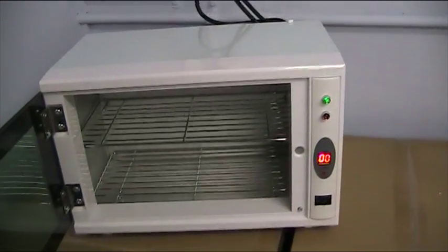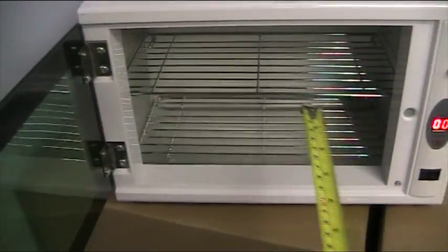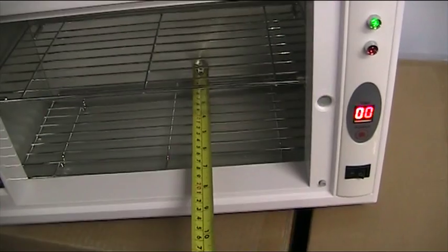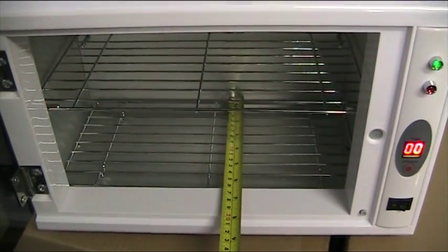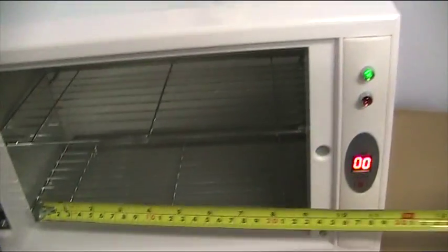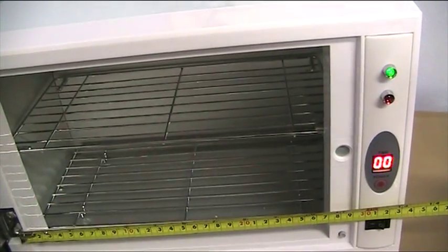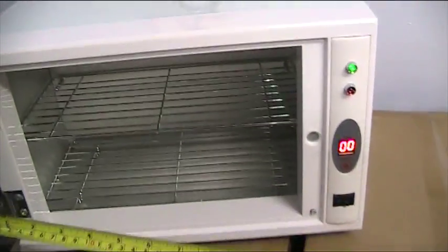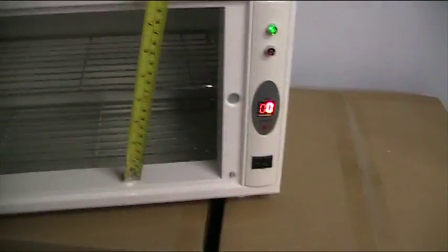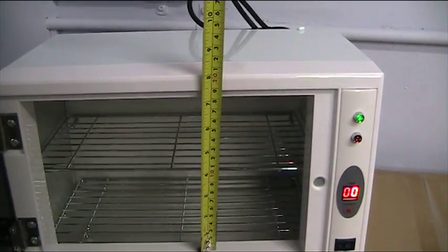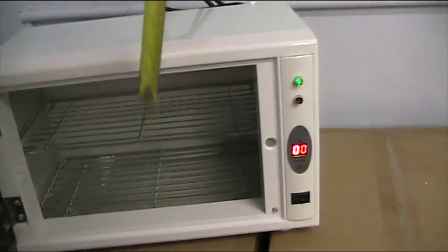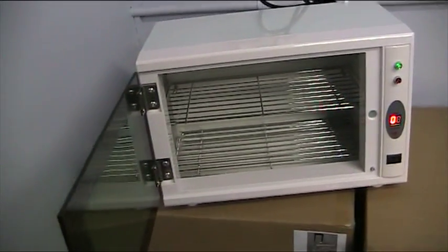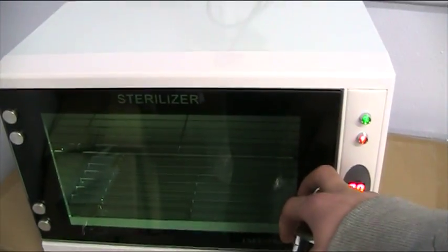The inside dimensions for this unit are 16cm by 26cm and 18cm high.